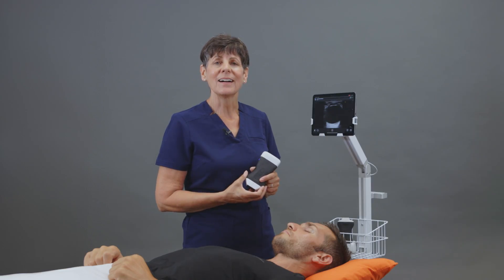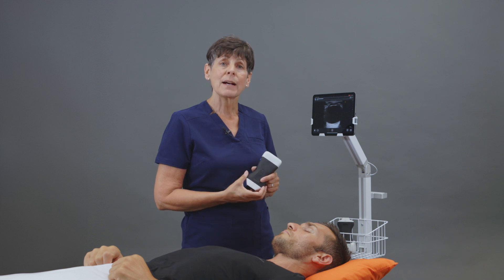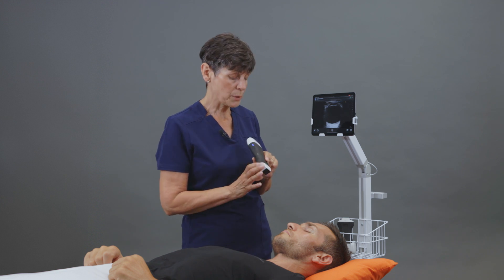Now for safety reasons, maximum levels for thermal and mechanical indices, which are determined by the US FDA, are lower for scanning the eye because of the way the eye experiences ultrasound's thermal effects. We have those limits built right into the ocular preset, so you want to make sure that you're using the correct preset.